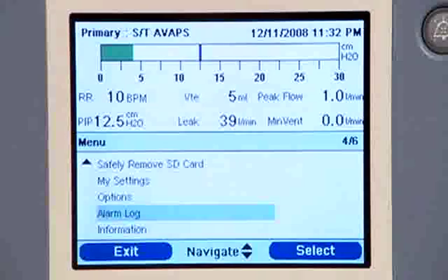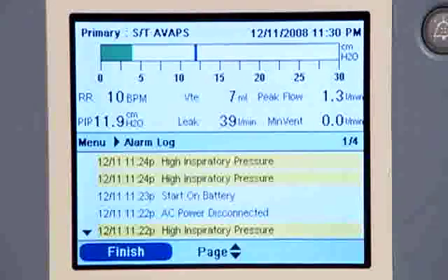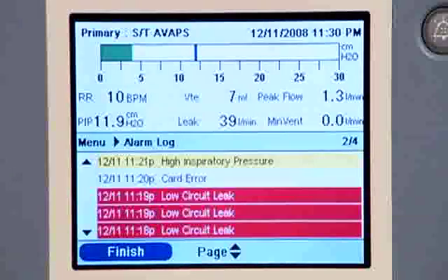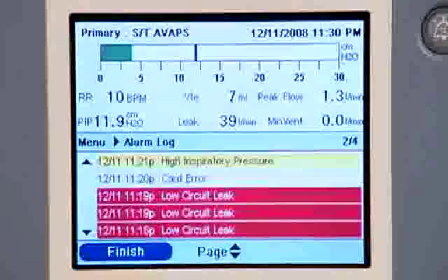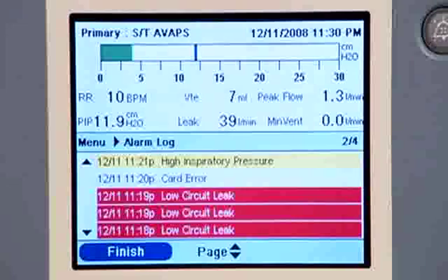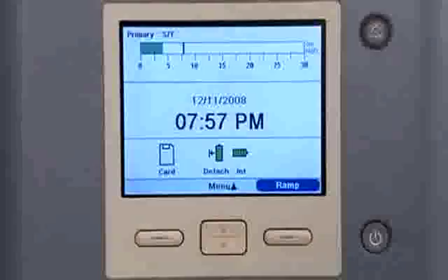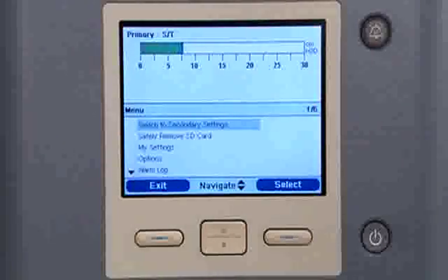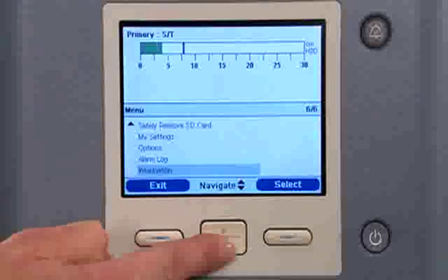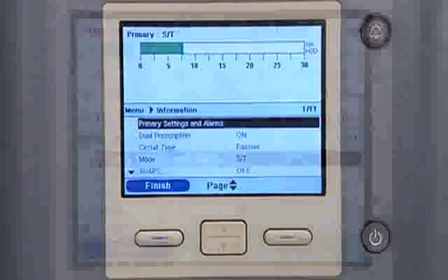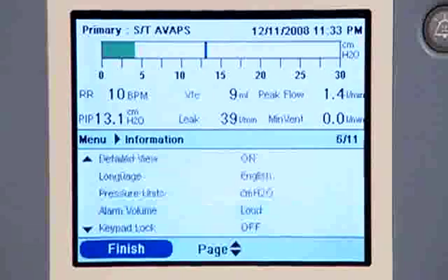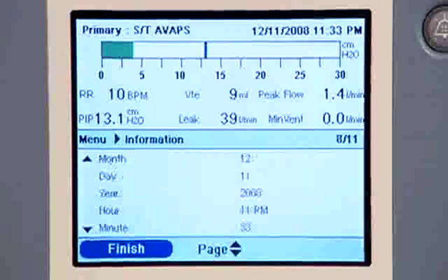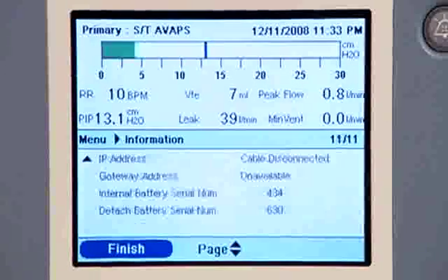Trilogy 100 also has an alarm log, which is very helpful to caregivers and physicians. The alarm log displays the 20 most recent alarm events, with the newest events shown first. The list shows the date and time each alarm occurred and how long it was on. Trilogy 100 also summarizes information about its settings so caregivers can find it quickly. Press the up button to get to the menu screen, highlight Information, and press select. Use the up-down button to scroll through current settings, device options, and system settings. You will not be able to make any changes in this section.